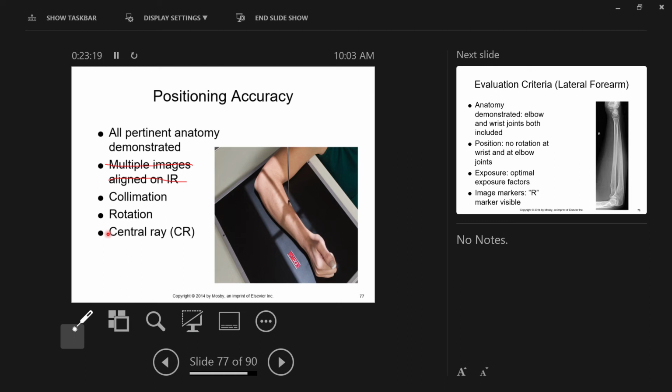Actually, that's going straight down. Yeah, basically. Think about your car headlights or a flashlight, right? When you shine a flashlight on a wall, the middle of the flashlight's beam is traveling straight at the wall. As long as you're pointing, so assume you're pointing the flashlight straight at the wall, right? The middle of that flashlight's beam is straight, not traveling at any weird angles, but the rest of that flashlight's beam spreads out, travels at an angle, right?